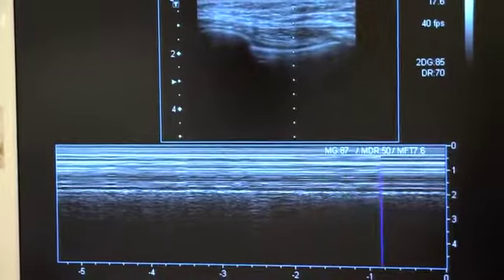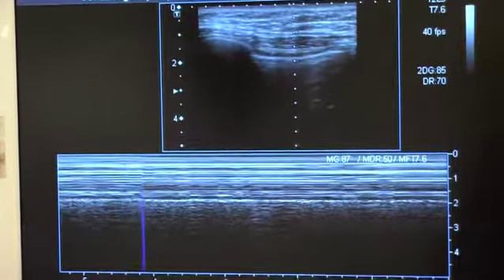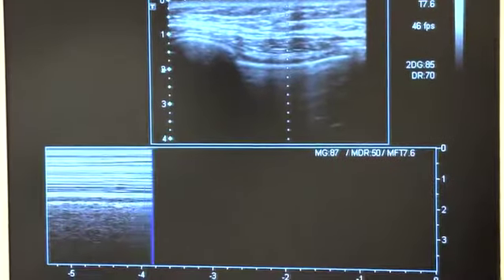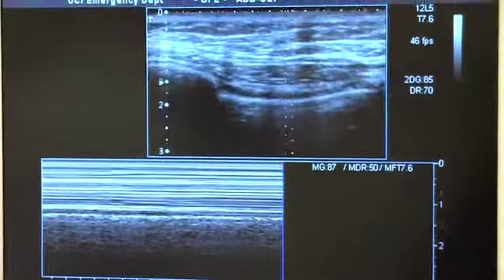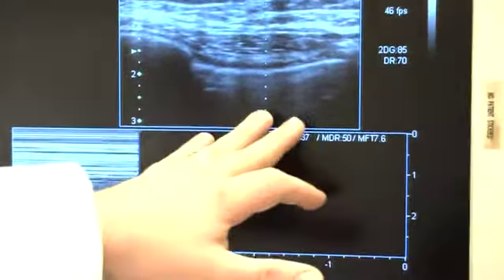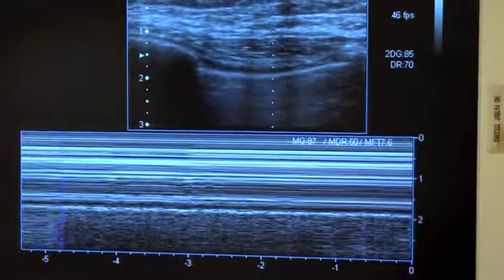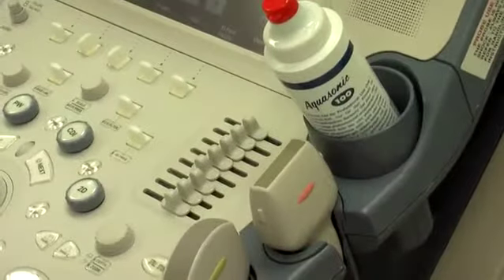And what we're looking for, again, I'm going to change my depth a little bit. I turn up the far field TGC also. It's a little bit dark in the far field here, so I'm going to turn up the far field TGC. See how I just slide these buttons over a little bit and it makes the far field a little bit brighter without changing the near field. And I can see clearly here, I'm going to hit freeze so I can show you guys.